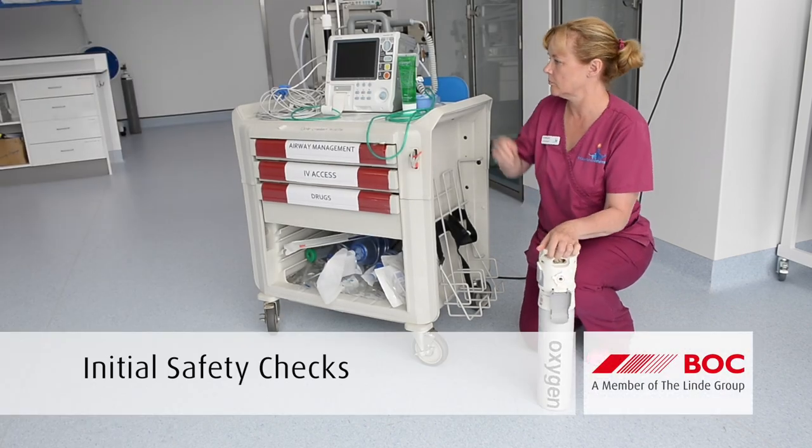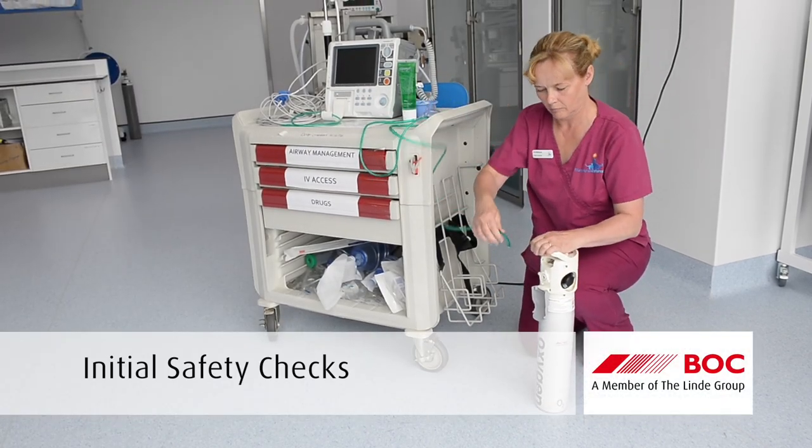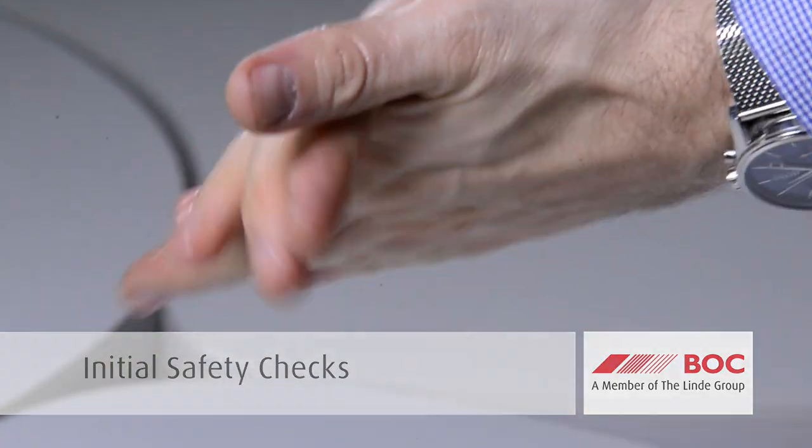Before handling cylinders, ensure your hands are clean. If you have been using alcohol-based gel or liquids to decontaminate your hands, make sure the alcohol has totally evaporated.